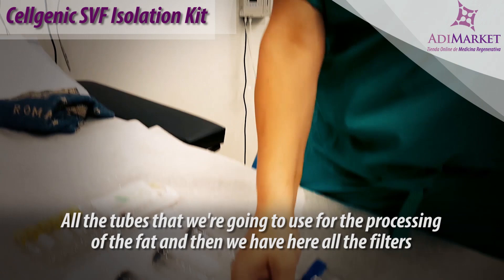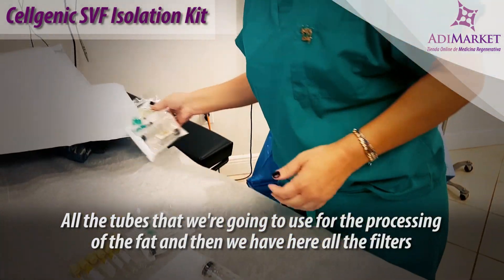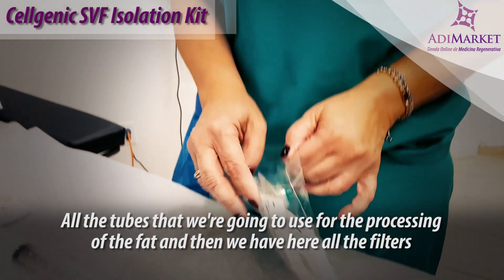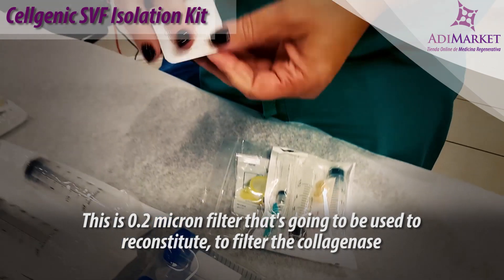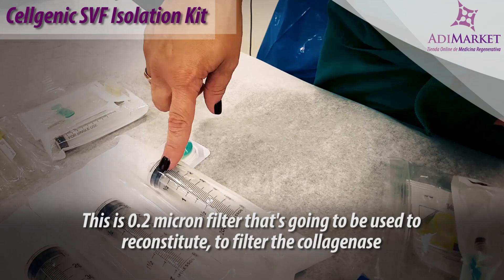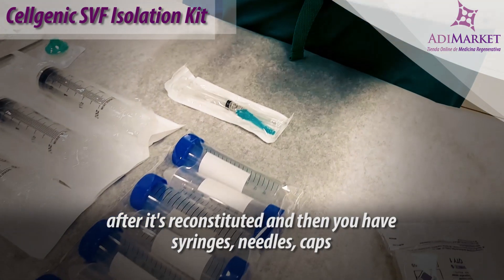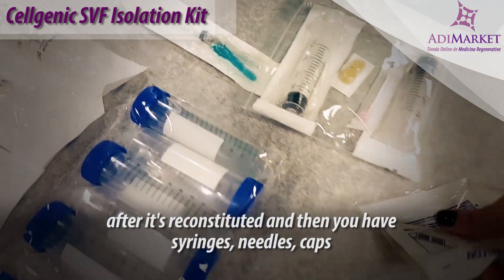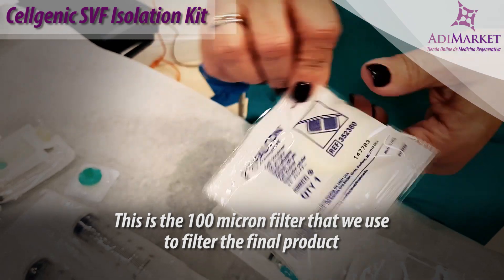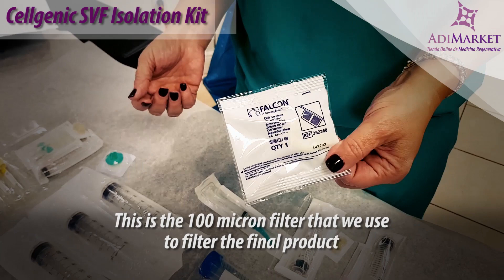All the tubes that we're going to use for the processing of the fat. And then we have here all the filters. This is a 0.2 micron filter that's going to be used to filter the collagenase after it's reconstituted. And then you have syringes, needles, and caps. This is the 100 micron filter that we use to filter the final product.